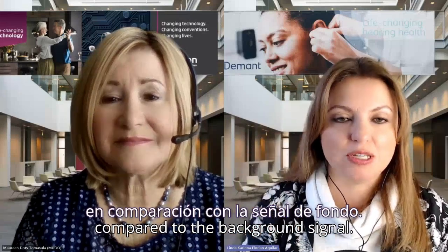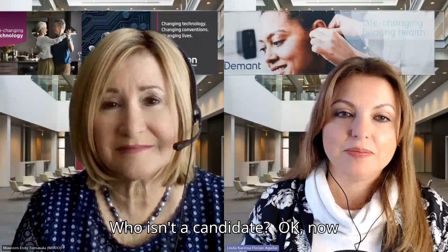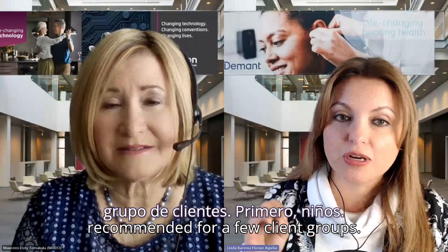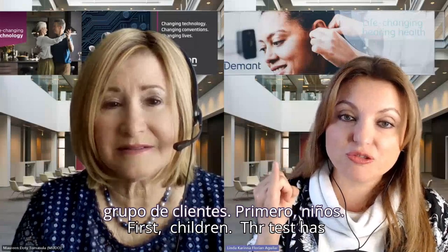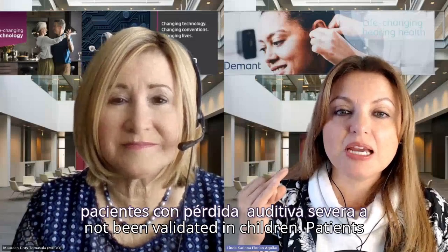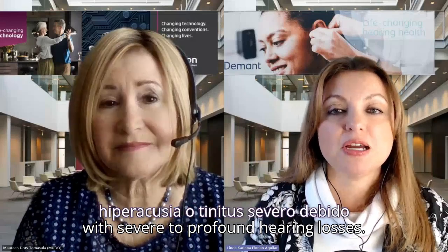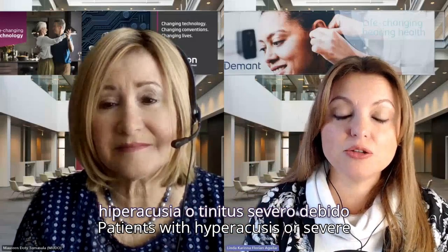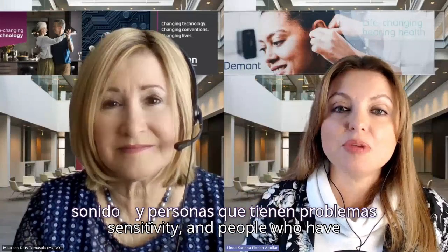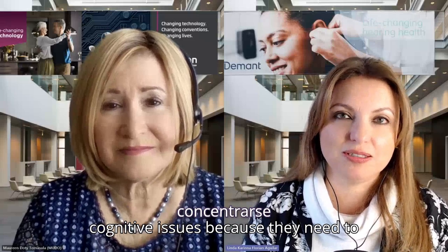Who isn't a candidate? Okay, now we have the ACT test is not recommended for a few client groups. First, children. The test has not been validated in children. Patients with severe to profound hearing losses, patients with hyperacusis or severe tinnitus due to sound sensitivity, and people who have cognitive issues because they need to concentrate.